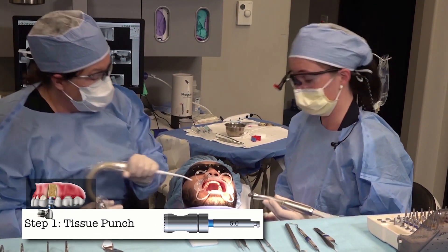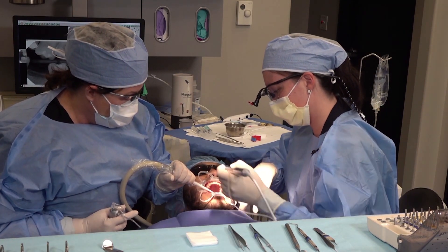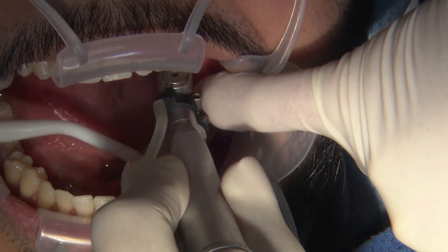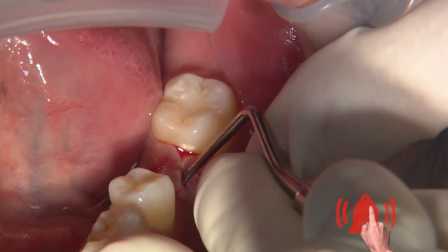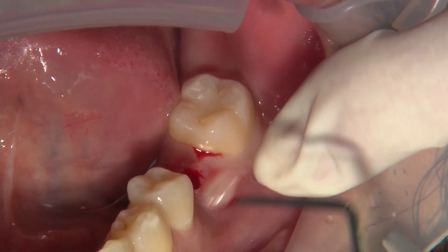We have previously anesthetized our patient so he is ready to go. This is going to take just a little cut around the hole at the site. The tissue will have to be further released, so I usually just take a little curette and get underneath it — and you can see it kind of just pops right out.